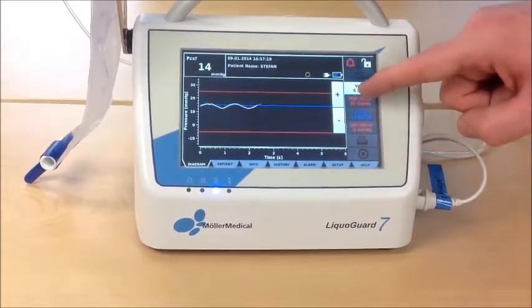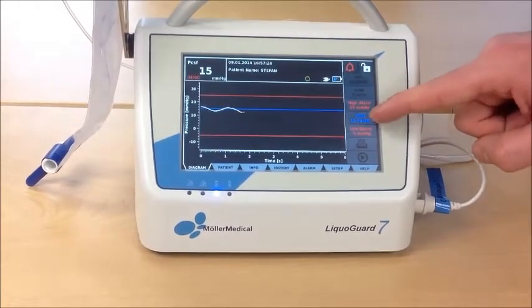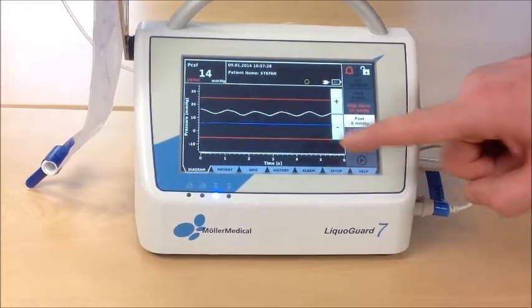For example, 5 mmHg. Then we level P set — the blue line — to, in this example, 5 mmHg.